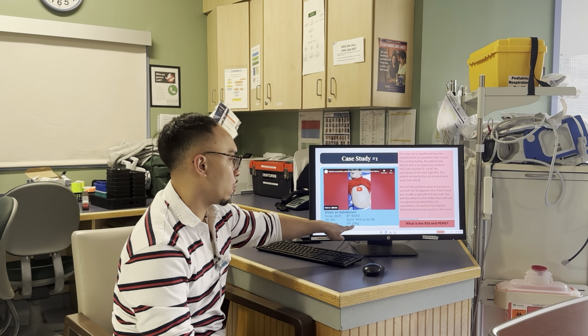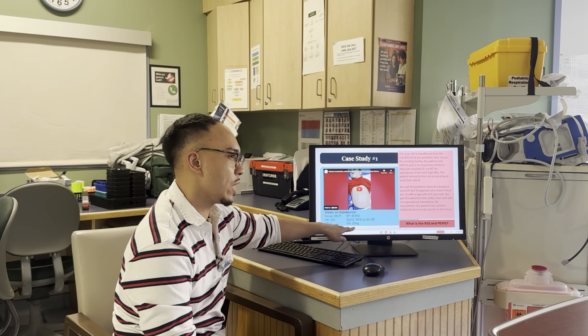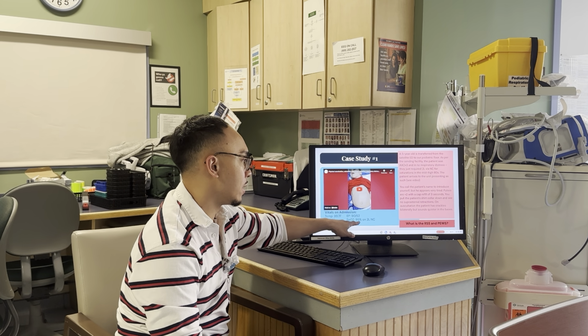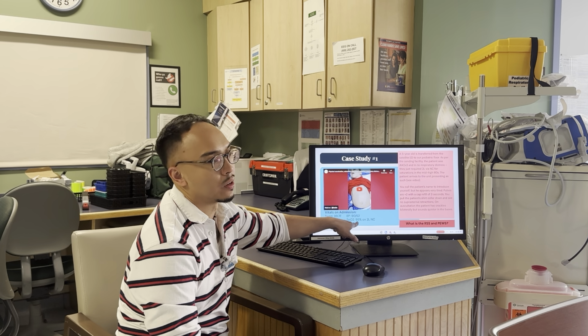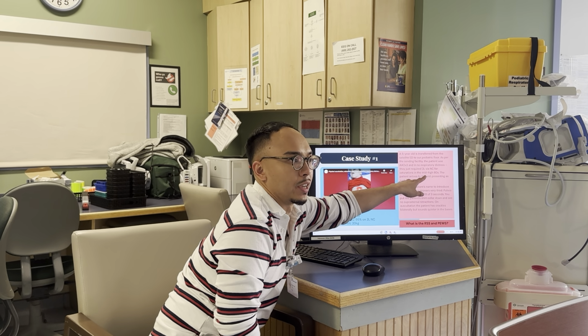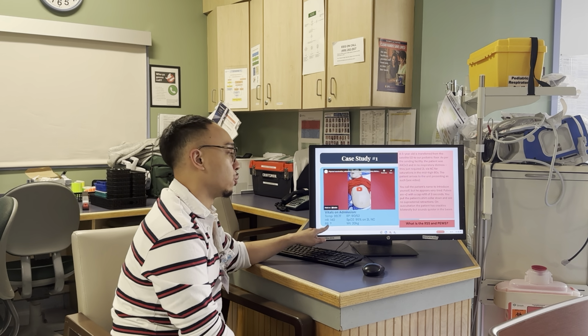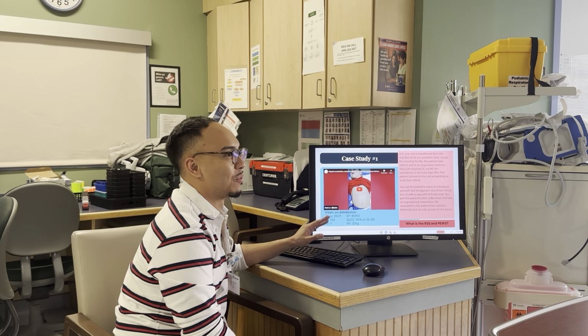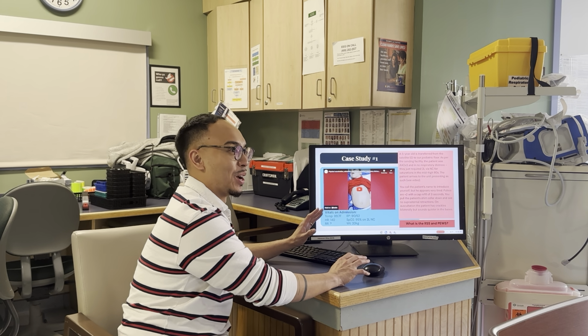Most noteworthy is the weight, right? We're going to need to know the weight for the high flow. BP 90/52. We know now on 2 liters, he's at 95%. But before then, he was like 80s, right? Also, we don't know the respiratory rate, so we're going to figure it out. I'm going to play the video, and you have to just count. You're good with counting your respirations?